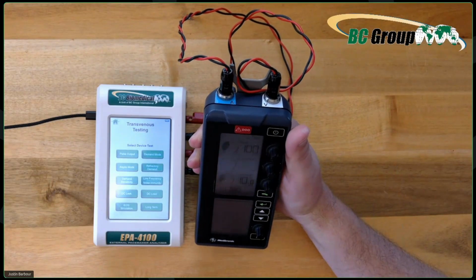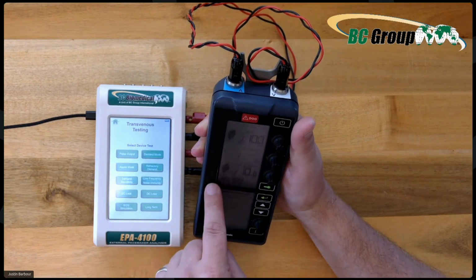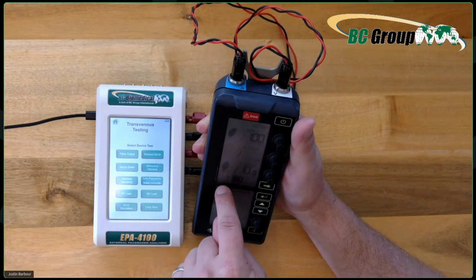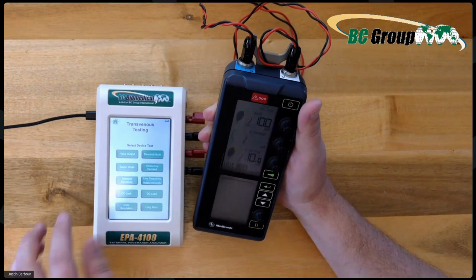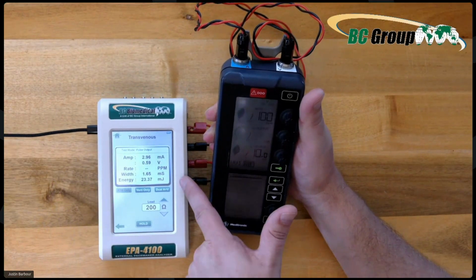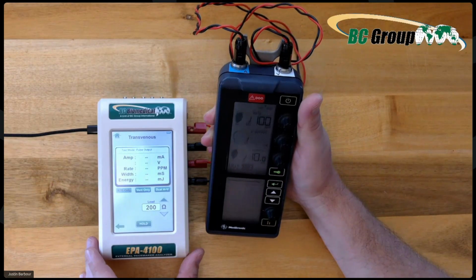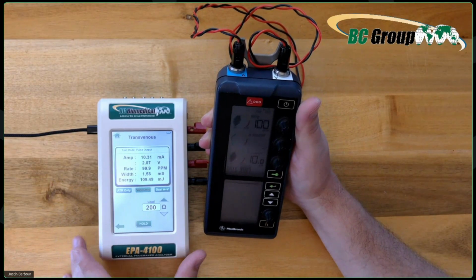I can turn it back on, but I'm no longer in VVI mode, because all we're doing is pacing the ventricle, sensing the ventricle, and I think it is being tracked. But when we go in here, we're on ventricle, and actually you can see right here, ventricle, there you go.